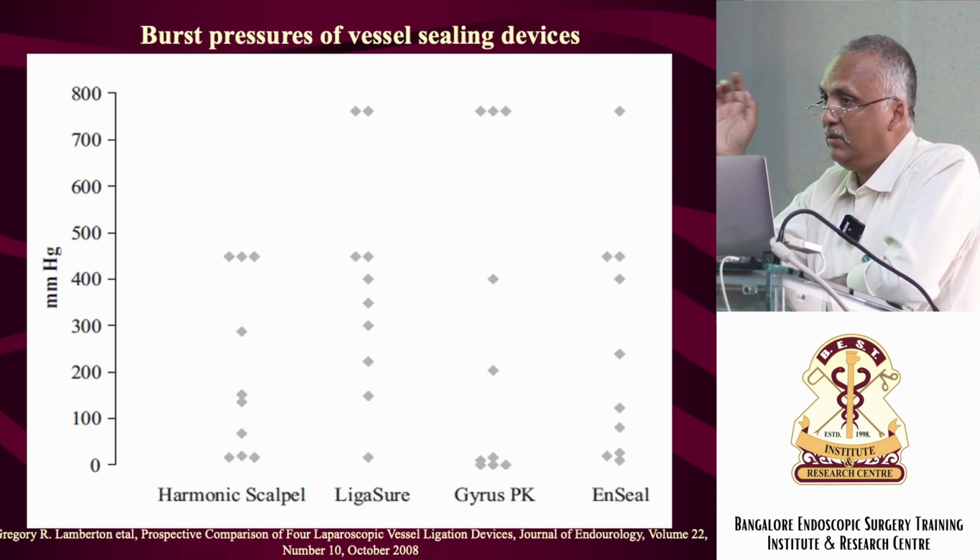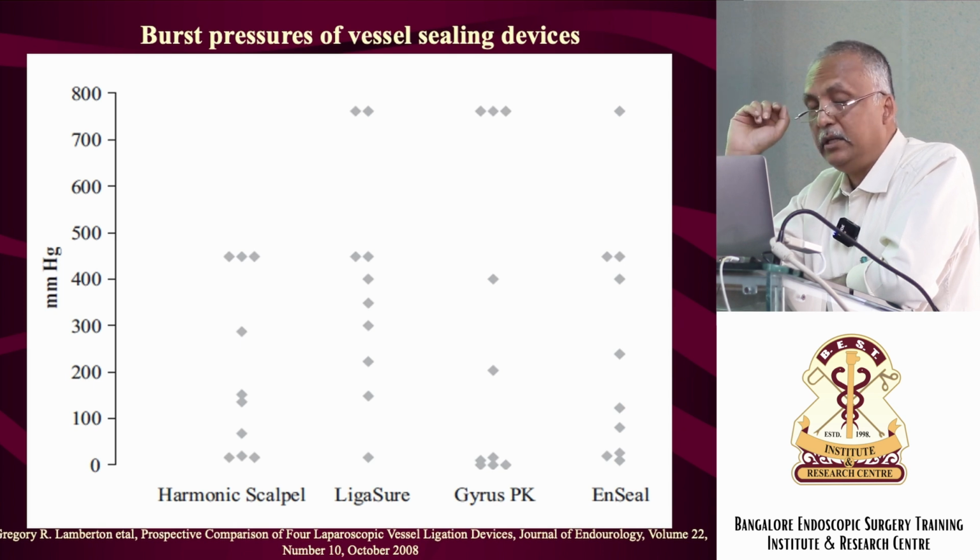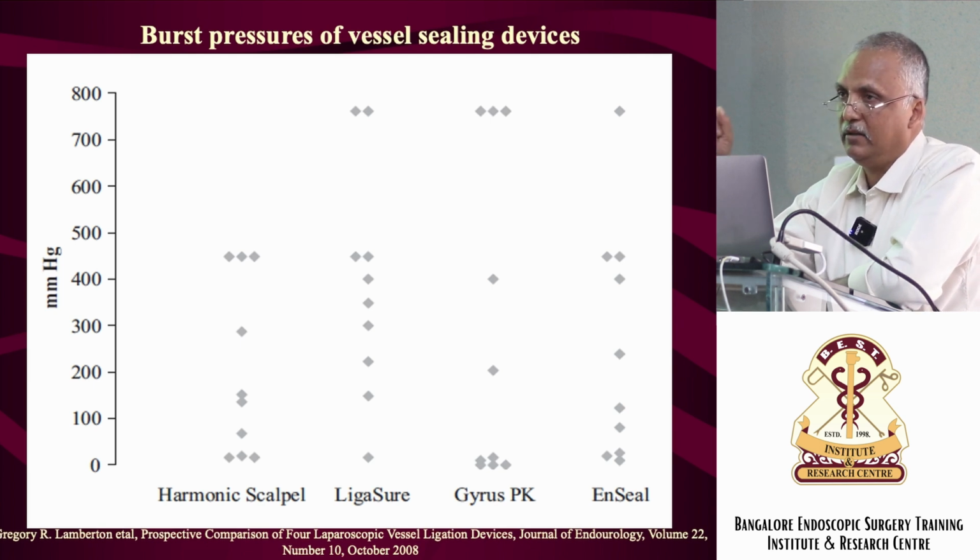Now what is the advantage of using lasers? There is no edema of tissue and so they don't have pain. So whether you cut piles, you cut any tissues with laser, the beauty of it is it does not cause pain.